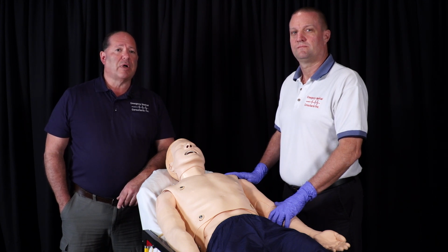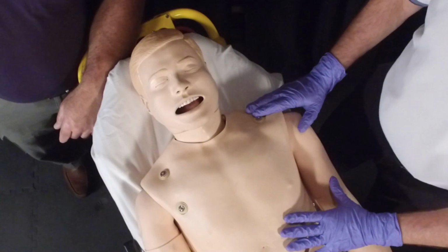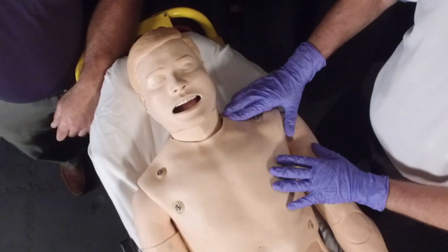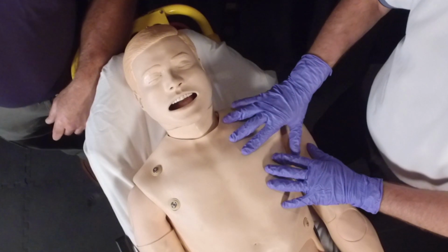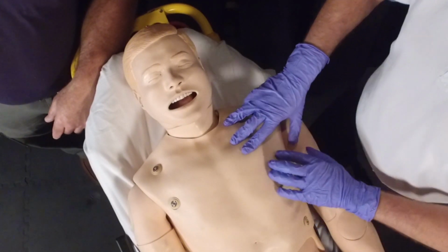We'll look at the landmarks and then we'll go through the procedure. So the landmark should be on the side that has no lung sounds, looking below the clavicle to the second and third intercostal space. Remember, just below the clavicle is the first rib, which would be the first intercostal space.